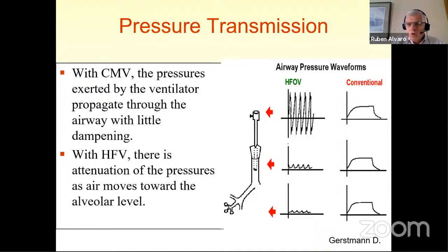So don't be fooled by those pressures, because sometimes those pressures could be higher than the pressures you are used to seeing on the conventional ventilator. But again, those are not the pressures that the alveoli is seeing. So with high frequency ventilation, there is attenuation of the pressures as air moves toward the alveolar level.